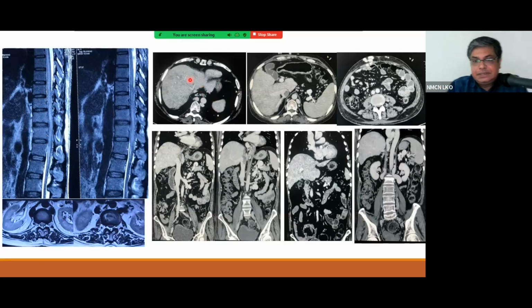On this axial CECT image, we can see obliteration of the LHV and RHV ostia, non-visualization of the RHV, with heterogeneous liver parenchyma, a nodular surface and caudate lobe hypertrophy. There is this accessory RHV, and we can see chronic thrombotic occlusion of the upper hepatic IVC with dilatation of the lower IVC and extensive paravertebral collaterals. The patient also has abdominal wall collaterals.